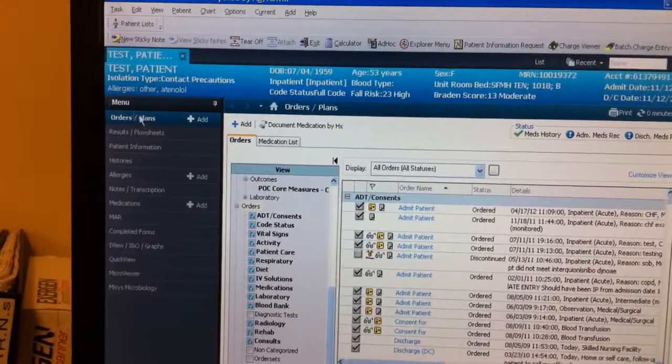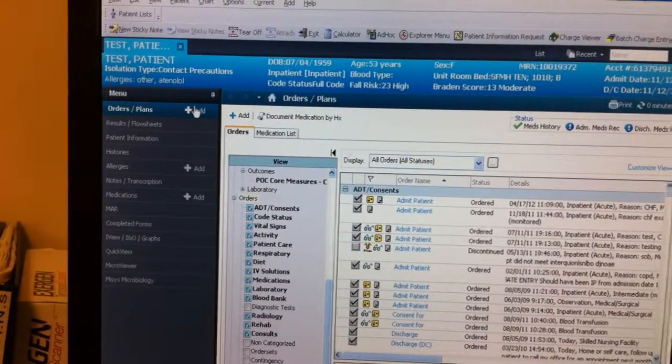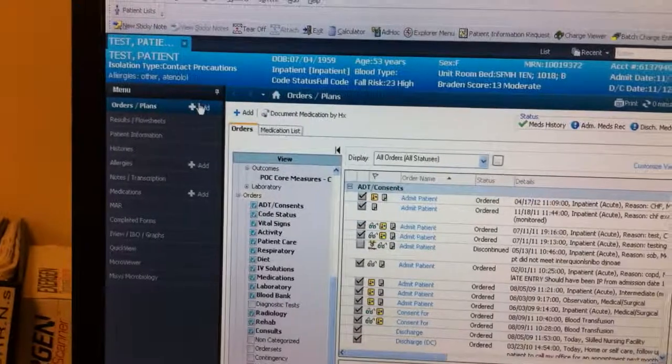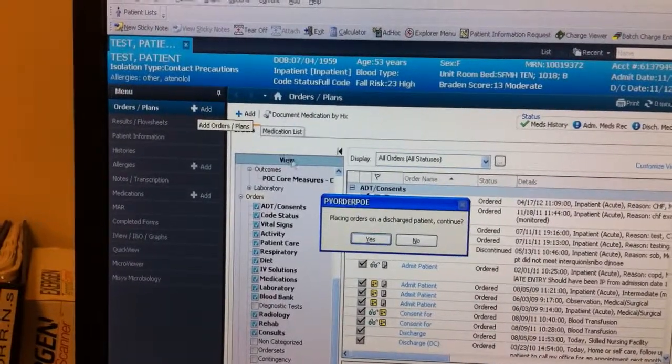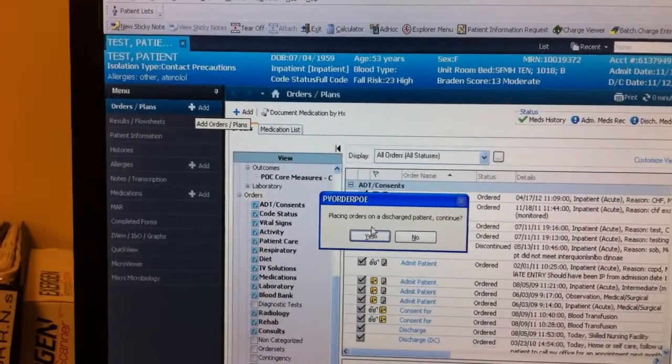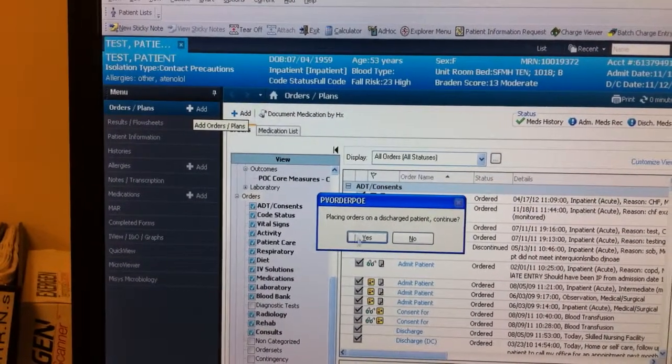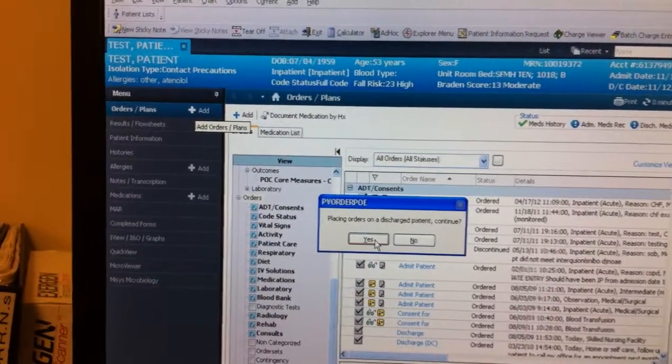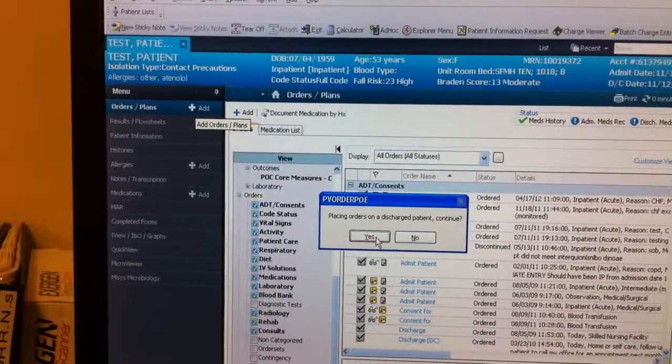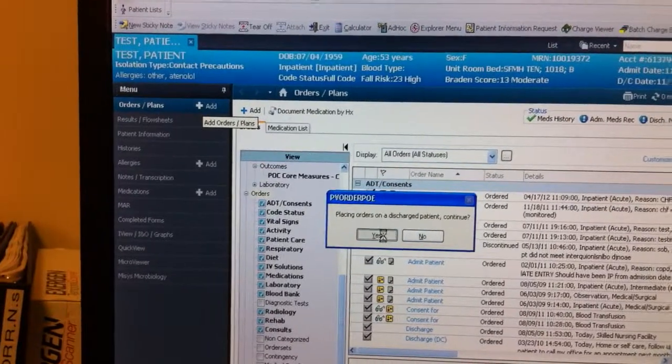Now we go to Order and Plans and we press the Add button. Because this is a test subject, we're just going to hit Yes.